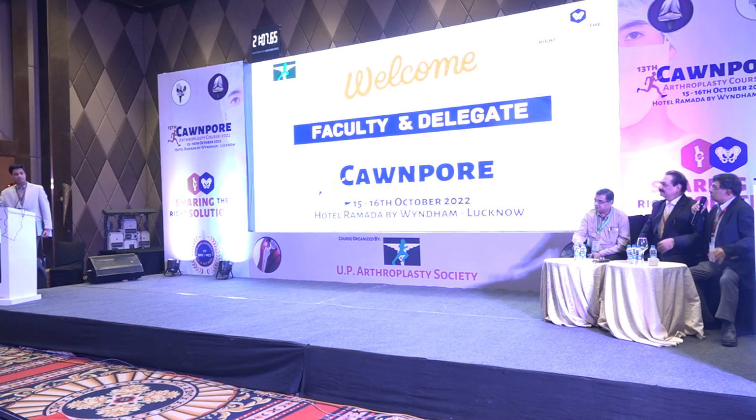Because the problem here is the fenestrations are filled with cement and it is a collared kind of prosthesis, so you can't get your osteotome in to break those bridges. So how do you tackle this?